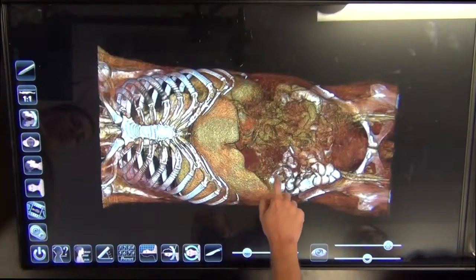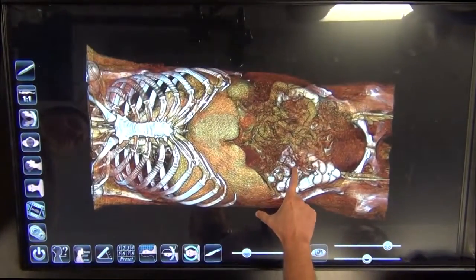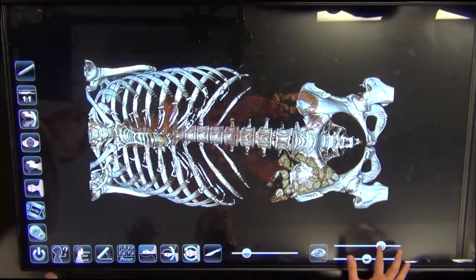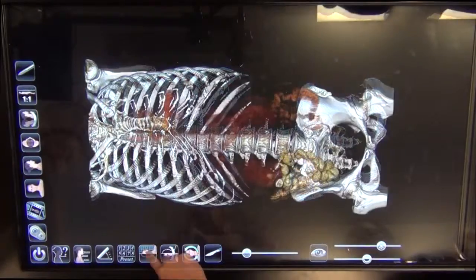If you guys had a patient that you're like, oh, we had a really interesting case of blah, blah, blah, and you have the CT or a DICOM and you want to load it, feel free to come in. We can help you put it up on here.